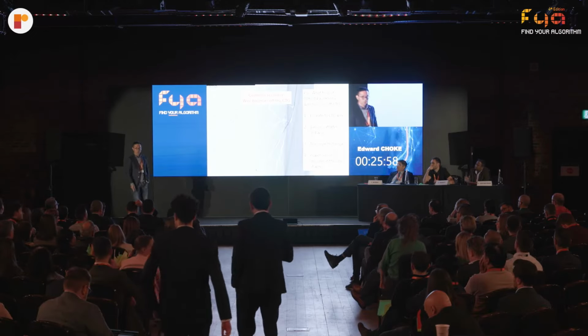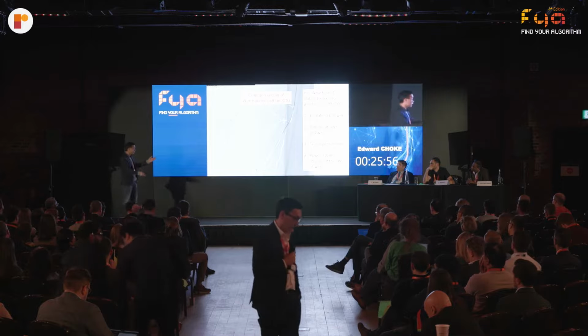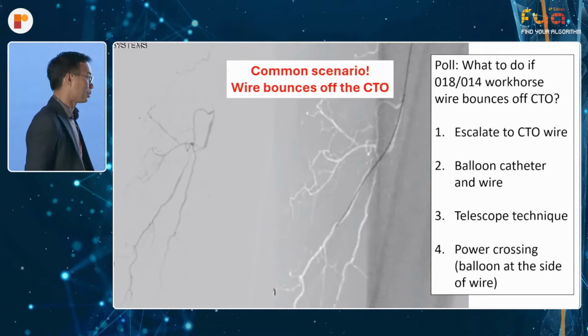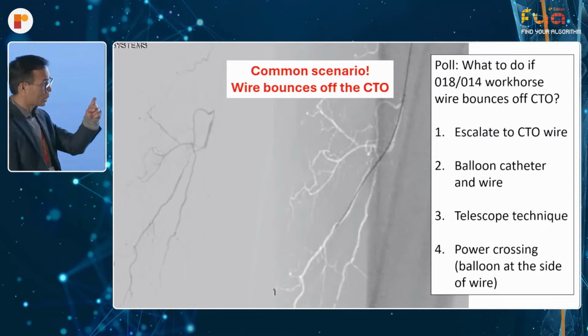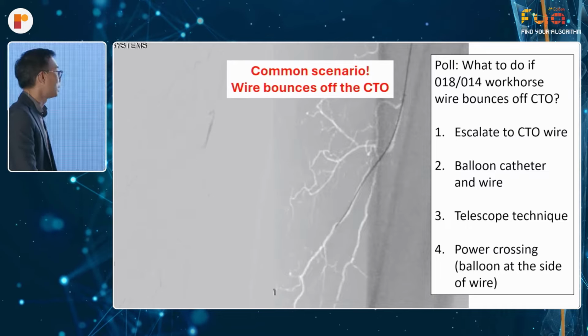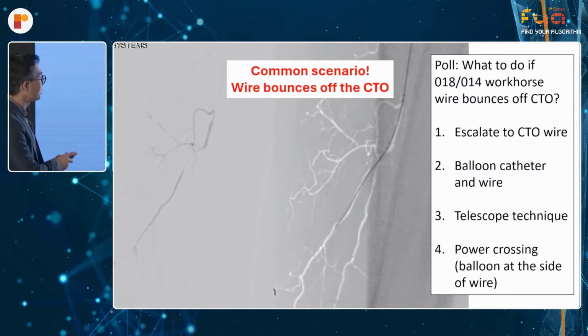Agree with all the points here. We can't tell exactly what happens in there. But as long as the wire sails down like that, you're in a microchannel, and you could potentially say this is how I would classify being intraluminal. If the wire knuckles, then I'm in the subintimal space. This is how I look at it. So this is a common scenario.